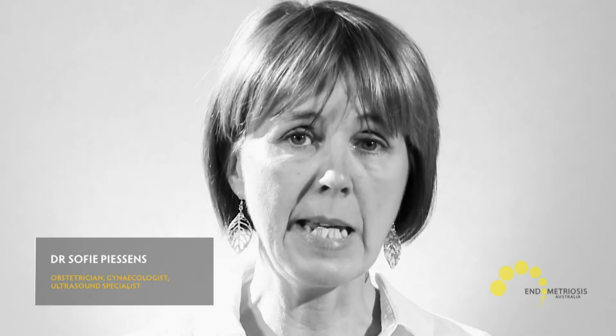Endometriosis in the more severe form, the complex form, however, can easily be seen on ultrasound, and it is particularly that we want to diagnose so that we can give the surgeon some warning about the degree of complexity that is expected during the surgery.